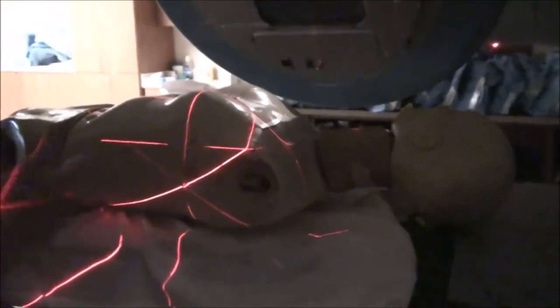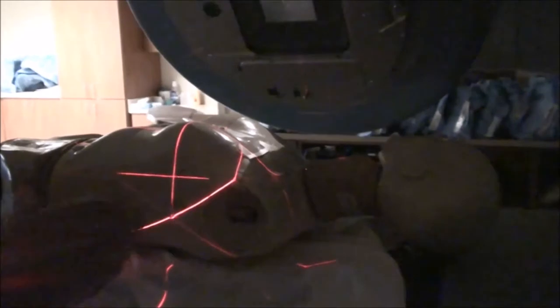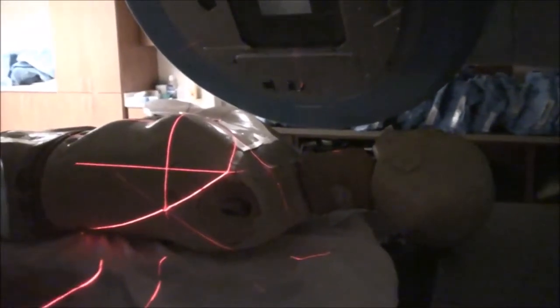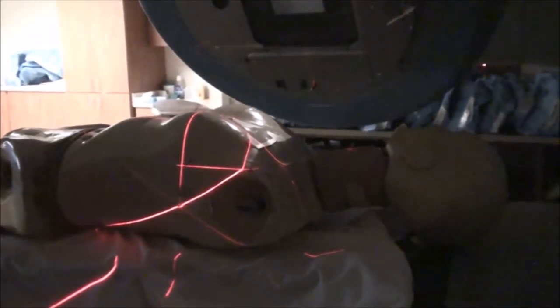You'll take your film — actually, you'll fluoroscope first. The doctor will look at it. You'll notate everything. Once you've notated, come inside the room and mark your CR. Once you've marked your CR, recheck your SSD — we've kicked our table and done all kinds of moves, so make sure the SSD is still proper. If you've still got a good SSD, then you take your film: center your eye, set your TFD, put your film marker on, take your film, and get it approved.